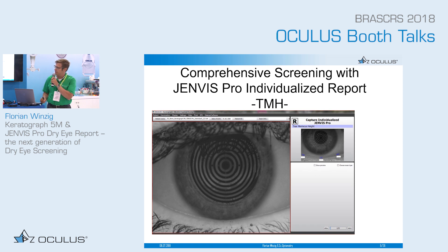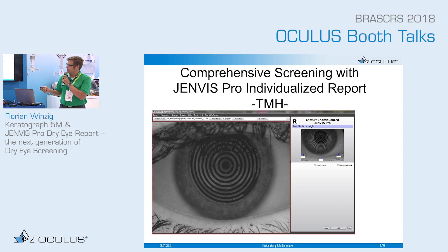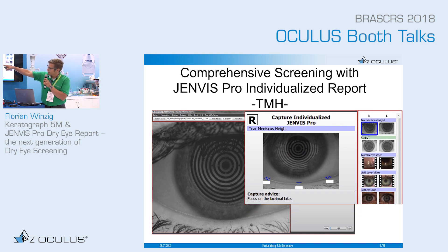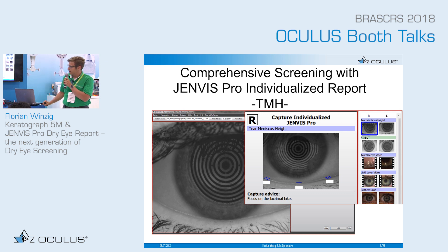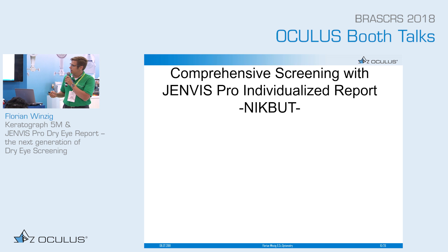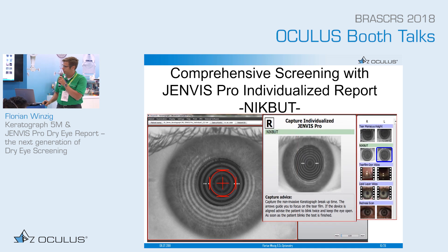Now I want to walk through the Genvis Pro individualized report in detail. Here we are in the capture session. On the side you see the live image, and there is a hint for the technician. We have thumbnail images to focus on the area of interest, and below that a capture advice which tells the technician where the patient should look and where to keep the camera focused. The second examination is the tear film break-up time without fluorescein.